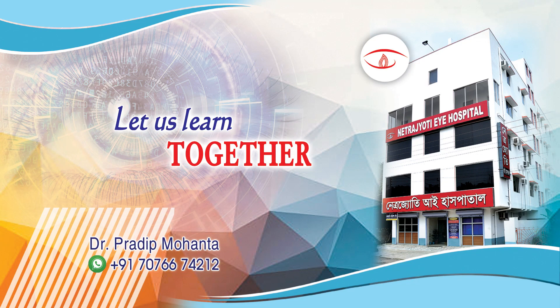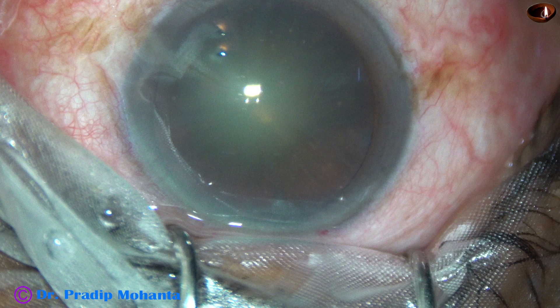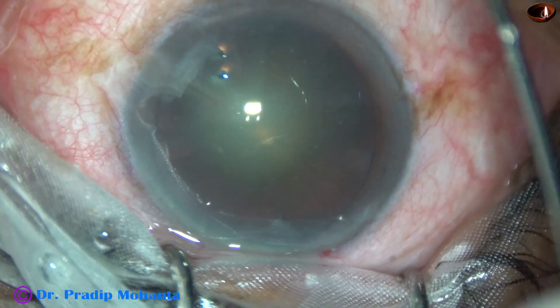Friends, welcome to my workplace at Ranagh Heart, West Bengal, India. This is a cataract with grade 2 plus or grade 3 nuclear sclerosis. Let us observe this surgery.